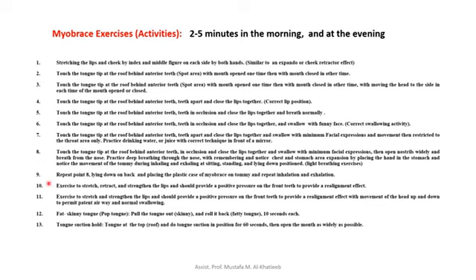Touch the tongue tip to the roof behind the anterior teeth with the teeth in occlusion, close the lips together, and swallow with minimum facial expressions. Then open the nostrils widely and breathe from the nose. Practice deep breathing through the nose, noticing the chest and stomach expansion by placing a hand on the stomach and noticing the movement of the tummy during inhalation and exhalation. Do light breathing exercises sitting, standing, and lying down.